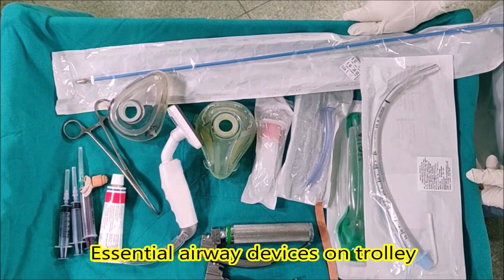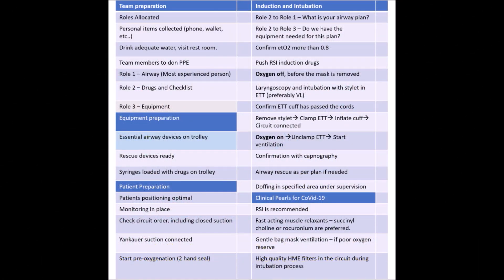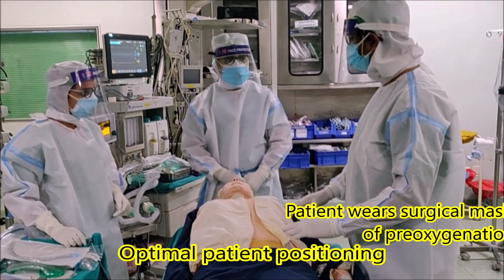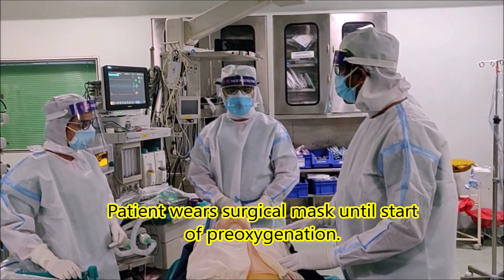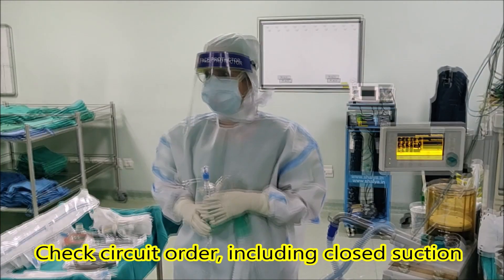Is the intubation trolley ready? Yes. Should we run the intubation checklist? Yes. Can you confirm the patient positioning is optimal? Yes it is. Is the monitoring in place? Yes it is there. Have we checked the circuit order? Yes.